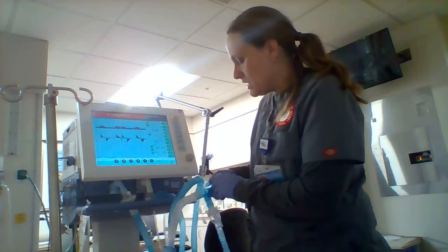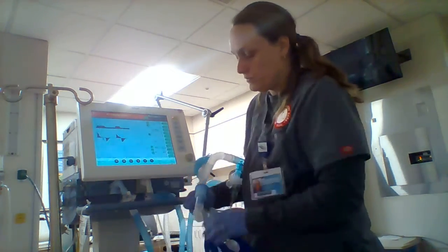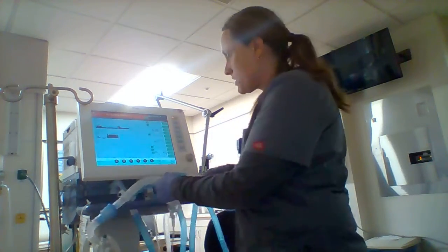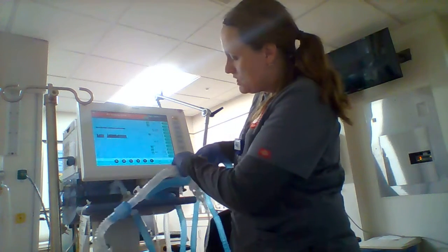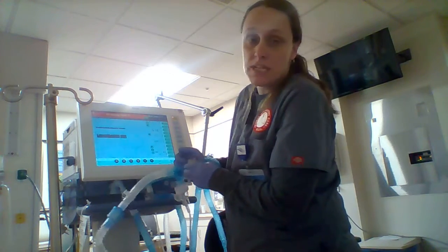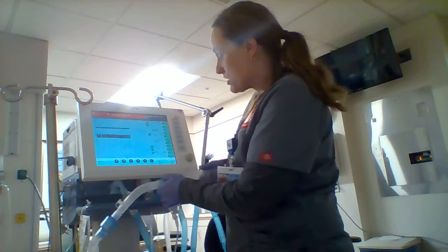The other option would be to do an MDI. So let's see what it does. It's going to be upset. So we have this little addition in our circuit. They do not do MDIs here, partially because they just don't like the landfill repercussions of that.